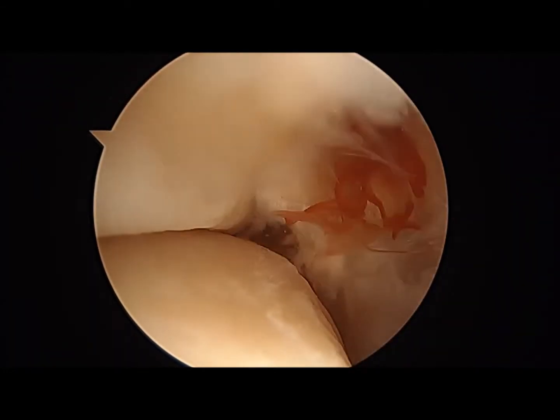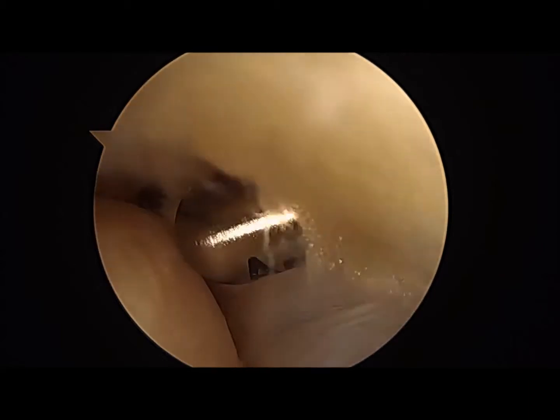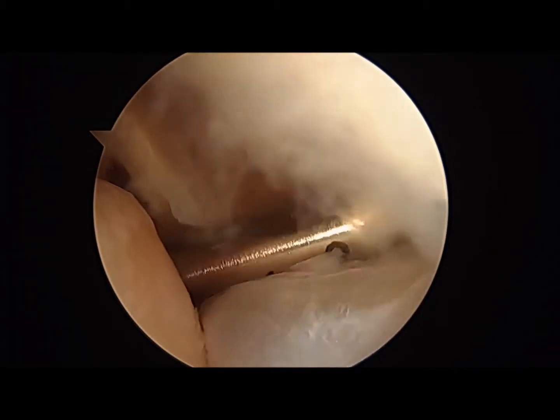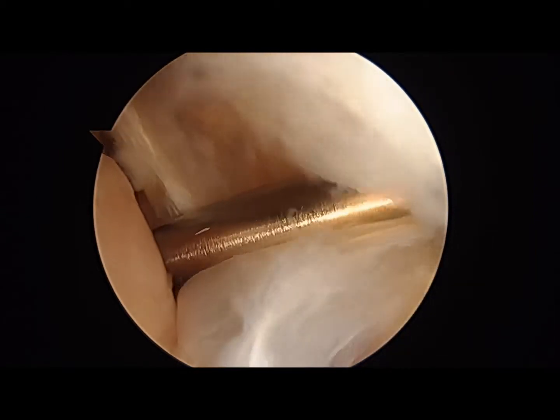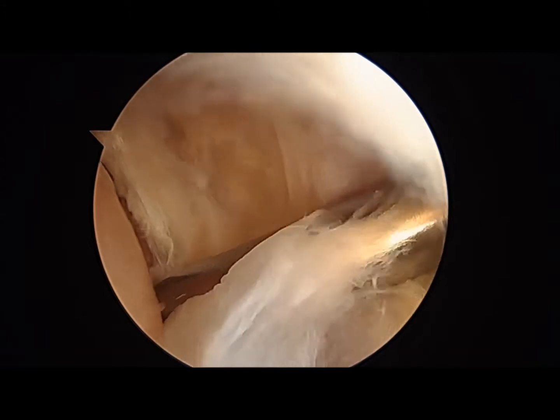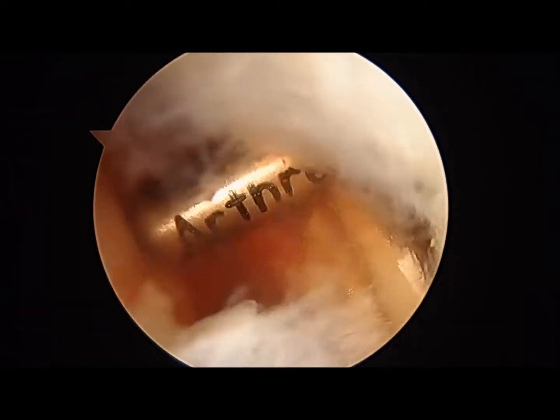Dorsiflex the ankle, get my equipment in there. Get some of that synovitic tissue out. This is the syndesmosis we're debriding. Going down the lateral gutter.